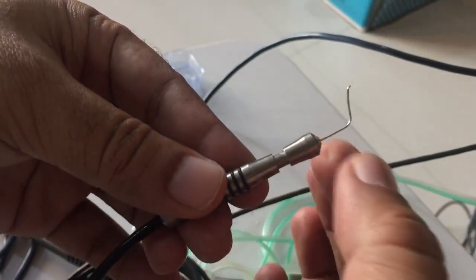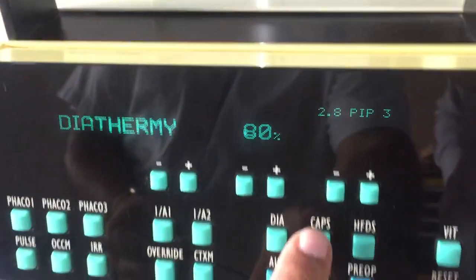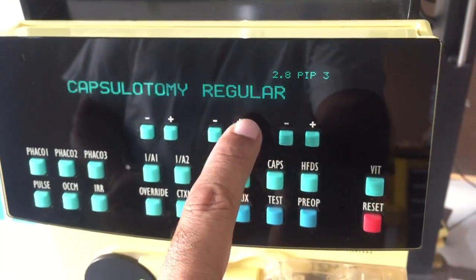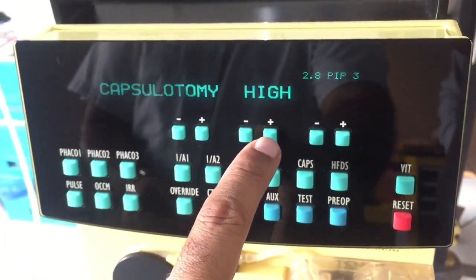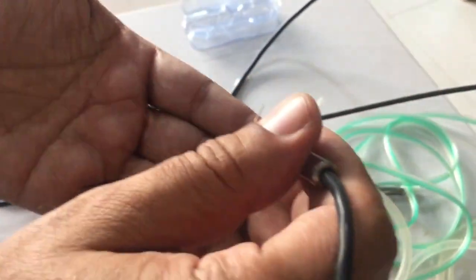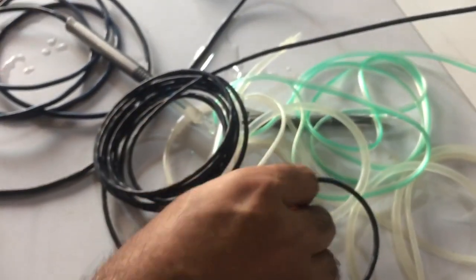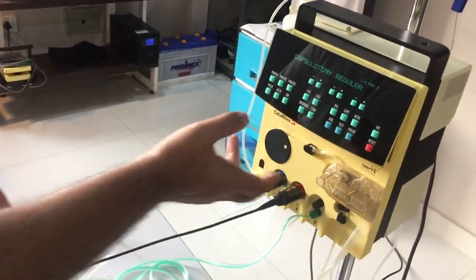In the same way, if you want to use the capsulotomy, you can mount the capsulotomy tip on this diathermy handpiece, and you have to select the function here, the caps, C-A-P-S, caps. So this is the capsulotomy regular, and you can use the high mode while working on pediatric surgery on the children. So normally it is used on the regular. So your capsulotomy is ready, and you can do the capsulotomy by pressing the foot pedal like that. So this is all about the functions in the machine. These are the major functions, and you can use them.